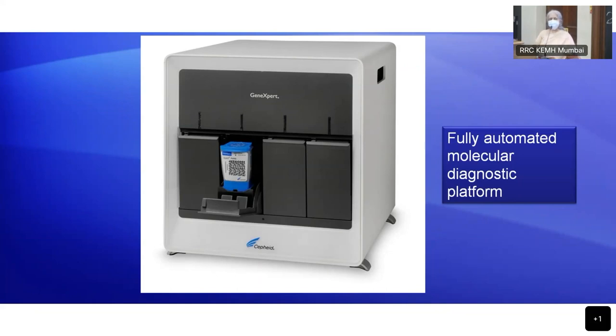Right? And it does not involve all those extraction activities. It's a fully automated system, and that's why it becomes very popular. But the technique that utilizes this machine is called CBNAAT. So you have CBNAAT for TB, which is used by the program, and you have CBNAAT also for COVID.